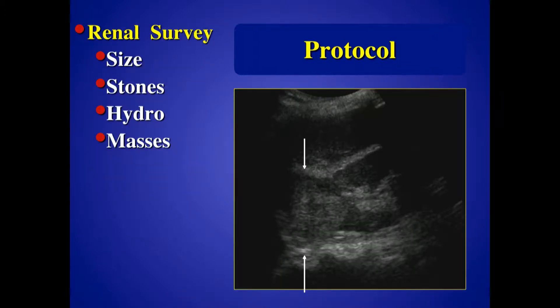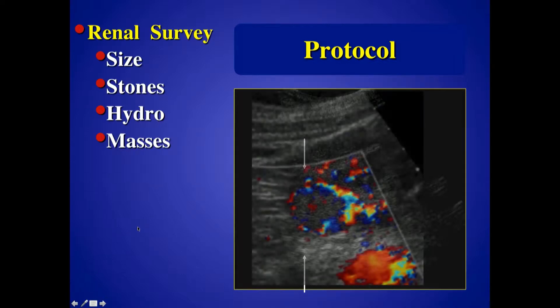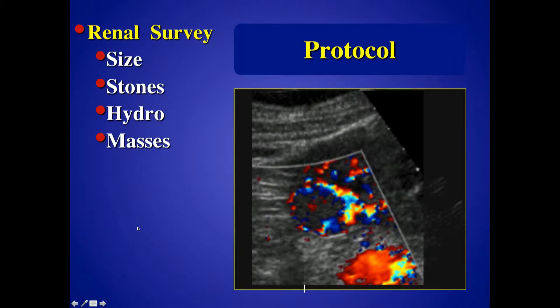Looking at the kidney first — look for evidence of atrophy, scarring, hydronephrosis, stones, and masses. Here's a patient with a large mass incidentally picked up from the upper pole of the right kidney. I put the color on, see tumor vascularity within it, and if it has high velocity flow I get concerned it's renal cell carcinoma — as was the case here. Incidentally picked up.